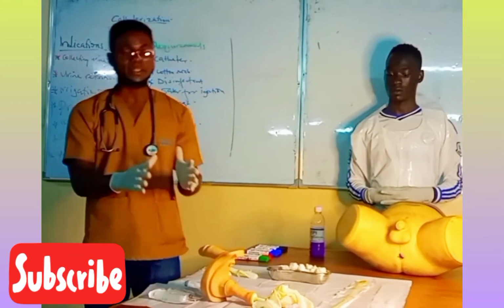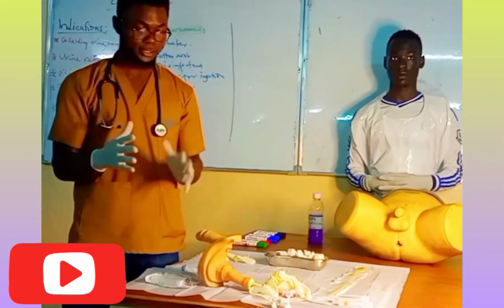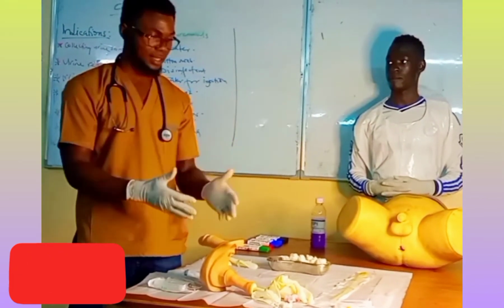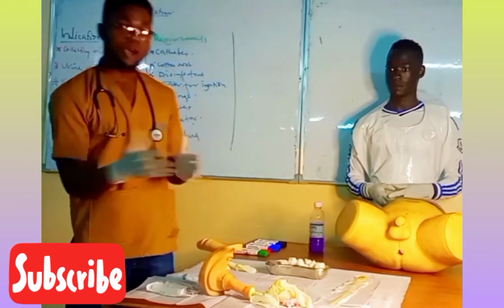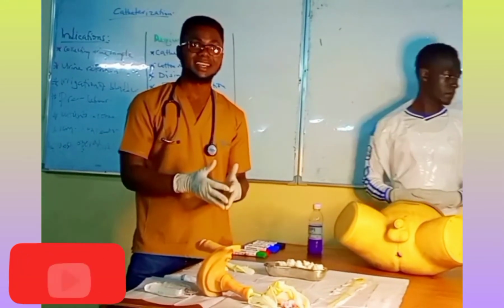So I've finished my disinfection. Then the second part is to insert the catheter inside the man. But before I do that, I will need to put on another pair of gloves, which are sterile.